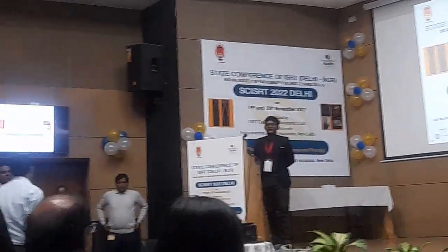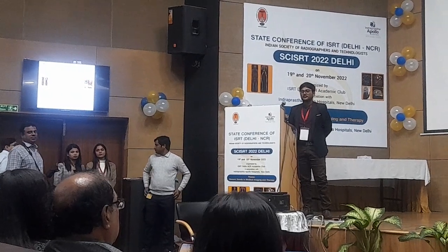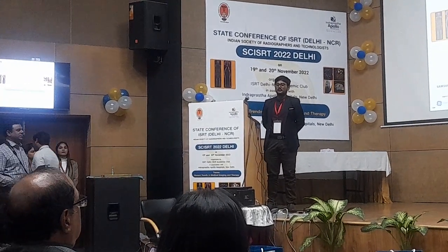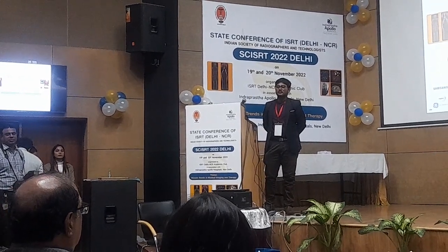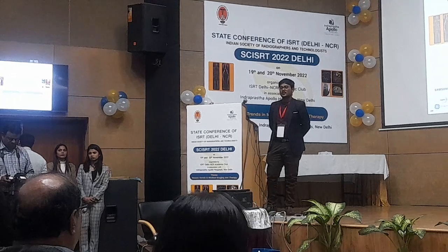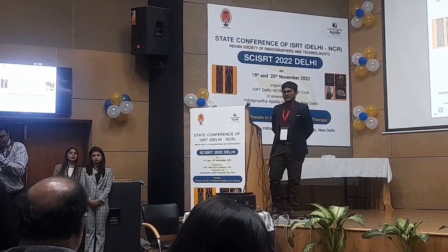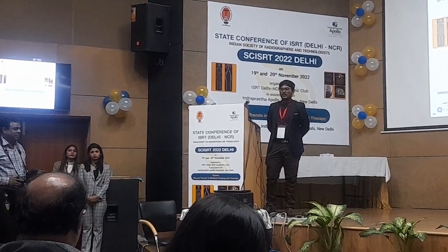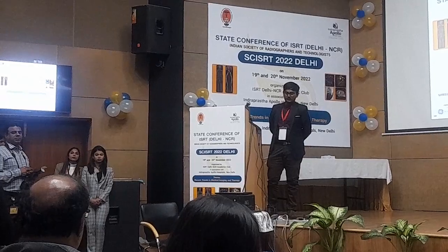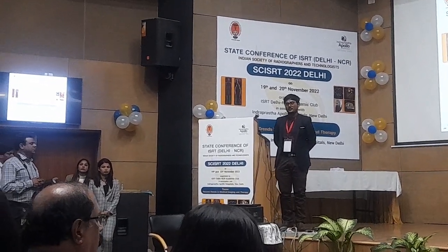This is not a question, just a comment. I appreciate your presentation, because temporal bone is not easy. My only comment is that you have done very well with the presentation, but don't stretch the images like this. The actual image was pulled like this, but that is not the way a radiologist or radiographer should do it. It should always be enlarged from a corner so that symmetry is maintained; otherwise it leads to anatomical distortion. This is just to learn for everyone.